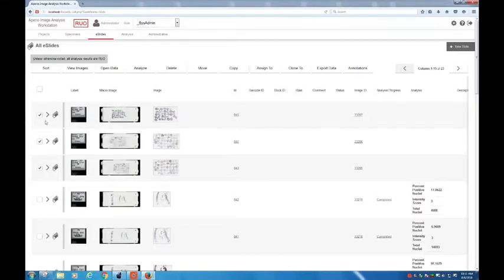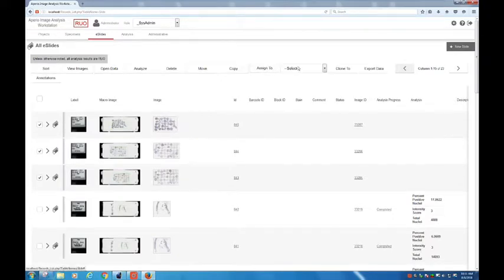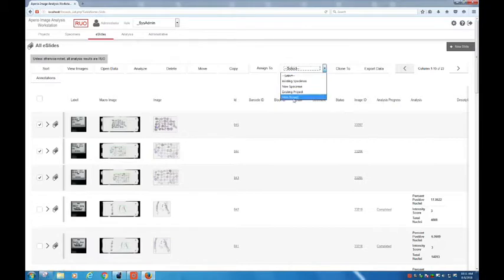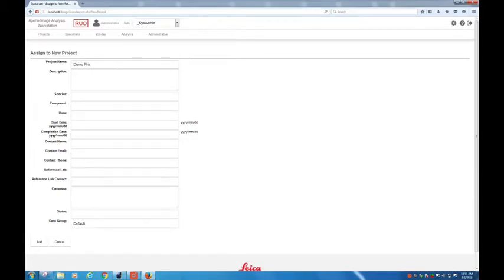You're going to want to select the boxes there on the left for the case and assign to, and click the assign button and new project. For the project name, I like to give it the accession number including the block number, so Part A, you put accession number A. Go ahead and add that case.